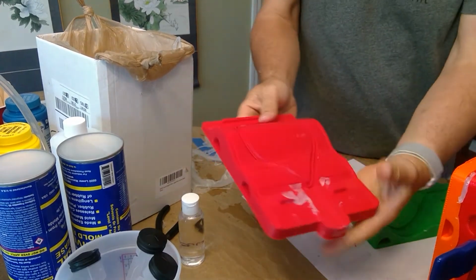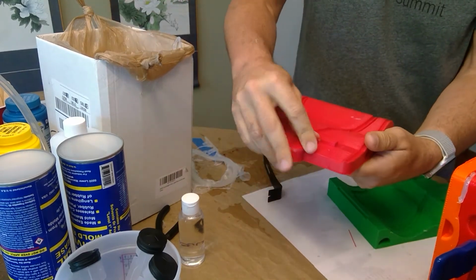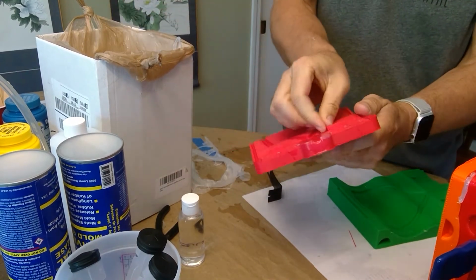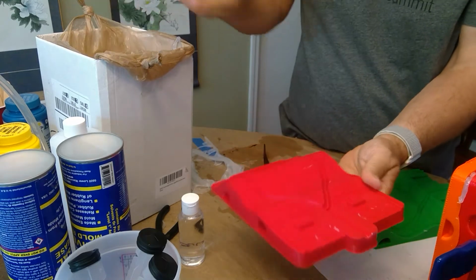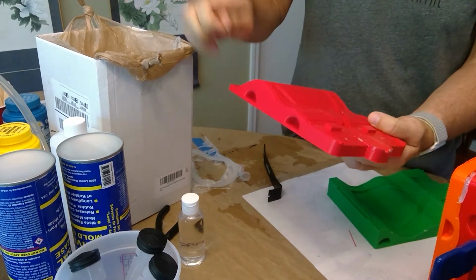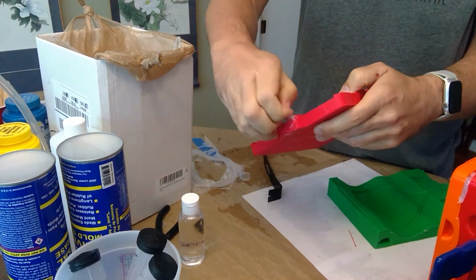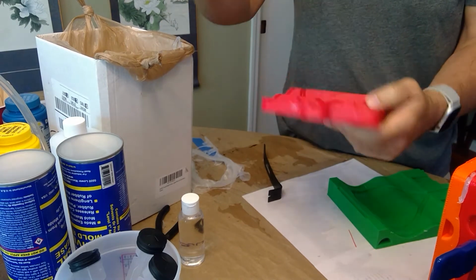Then you remove the rest of the silicone from the mold so that it's clean and ready to go for the next time. So you'll see there's lots of little pieces here and there. The better of a job you do with the mold release beforehand, the less cleanup you'll have to do later.